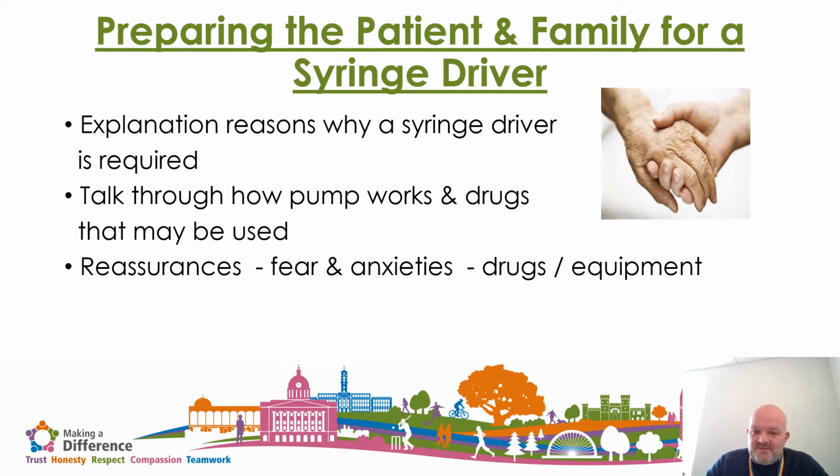We need to explain that that's not the situation, but sometimes if they've been taking oral medication and it's not being absorbed properly, once they are put on a syringe driver, those doses are absorbed better, so there may be some side effects. So they may feel a bit more drowsy for the first 24-48 hours, but that should soon pass. And because we're reviewing that syringe driver on a daily basis, these things can be picked up and managed as needed.